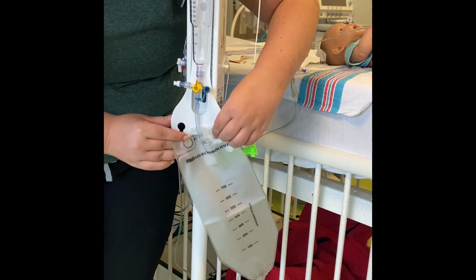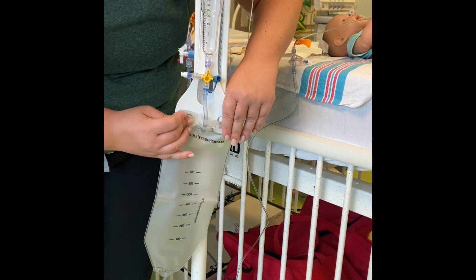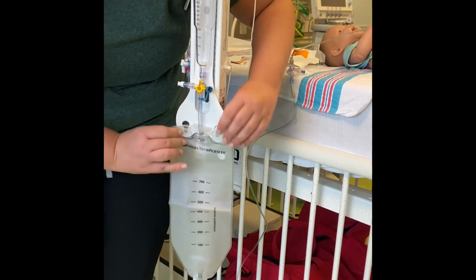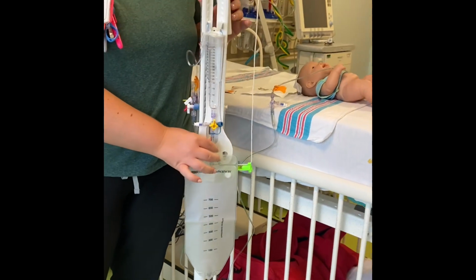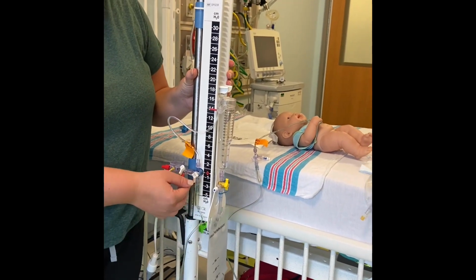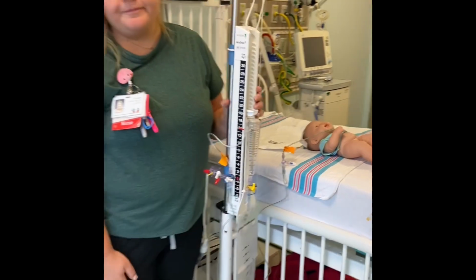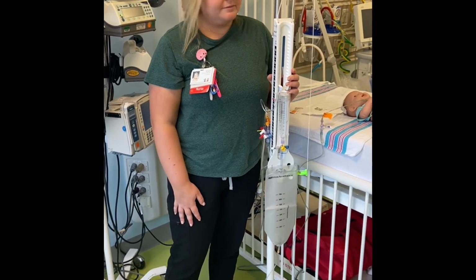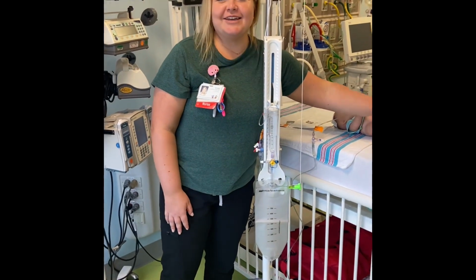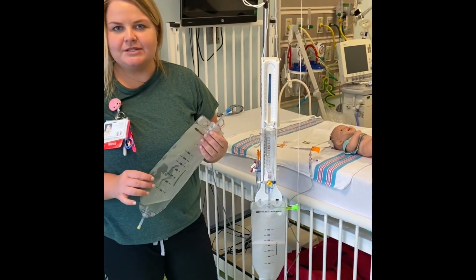You then can take the 2 circles and lift them up to slide them into place. At this point, your new bag is attached. So as long as you're still level with your patient, you can take this stopcock over here and open your patient back up. You then take your old EVD bag with it capped, and this is going to be disposed in the biohazard.